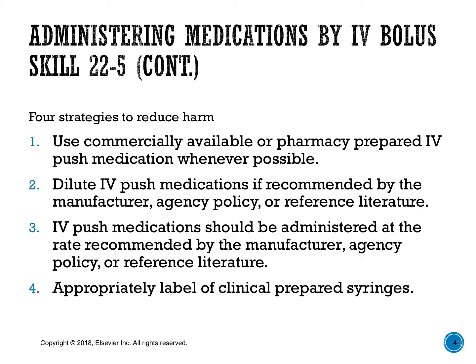Additionally, when you look up medications, you will find out the rate to push it. So how fast you can push it, how many milliliters over a minute or milliliters over 5 minutes. It just depends on what the medication is. So look it up, make sure that you know what the rate is, and you go ahead and push medications according to that rate. You may see nurses do all sorts of things.